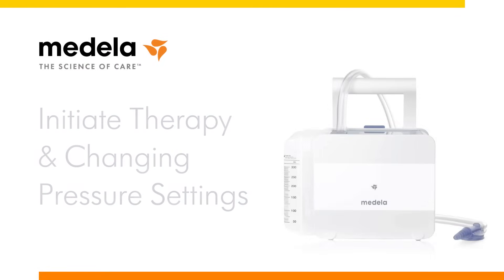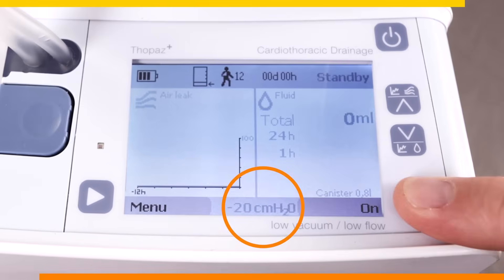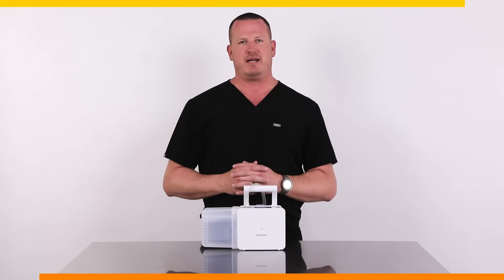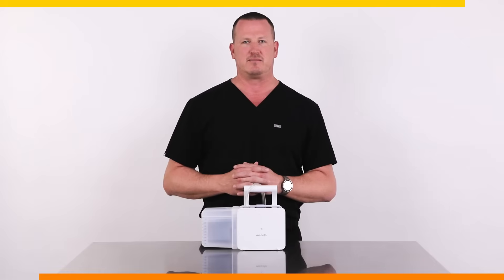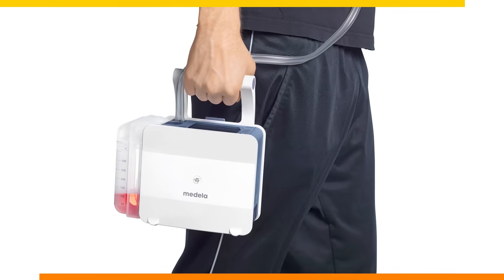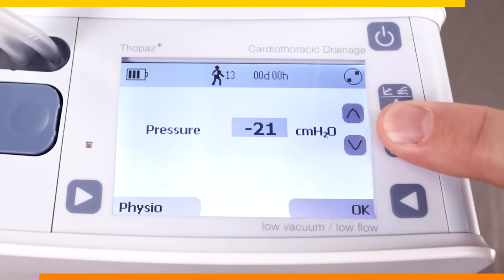Now we are ready to begin therapy. Connect the patient connector into the chest tube and ensure that the pressure on the bottom center of the screen is correct. Press ON to begin. The Topaz Plus provides its own battery-powered, regulated suction source. This means that fluid will always be draining into the canister and there is no need to pick up the tube to drain it, thereby removing the siphon effect that can occur with analog systems. Patients can also mobilize while having continuous suction applied to their drains. To change the pressure mode during active therapy, press the bottom left and right arrows simultaneously and use the up or down arrows to adjust the pressure.